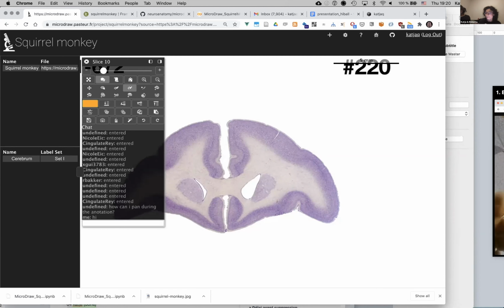Sometimes in my slices, for example, one fold is cut in a way that, as Konrad described earlier, you have a little island. In that case, I choose color number 3. I select region number 3 and draw this little thing so that I can subtract it from the region that I drew, to get the little hole where the new fold is already starting in my slice. I can maybe show what I mean.